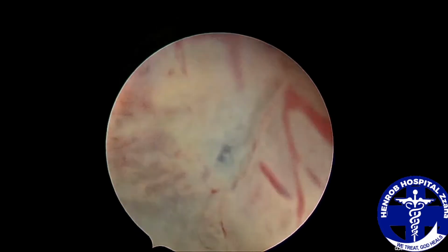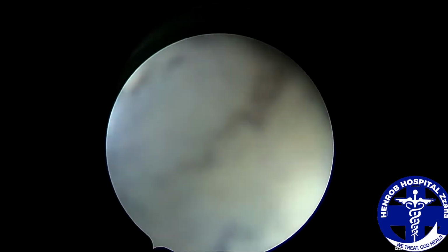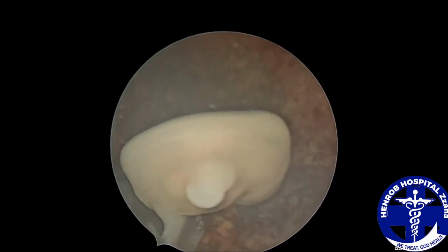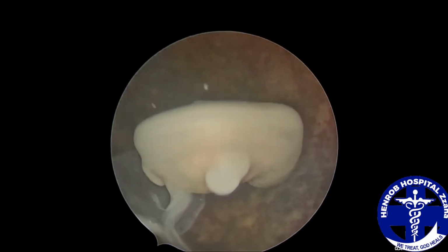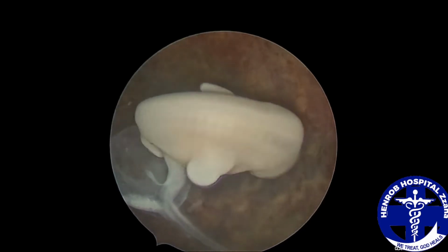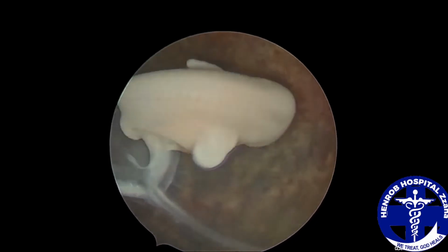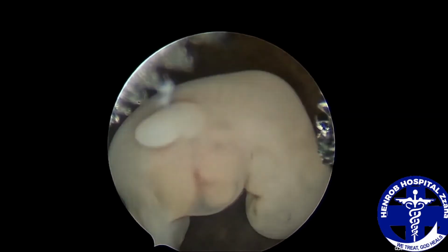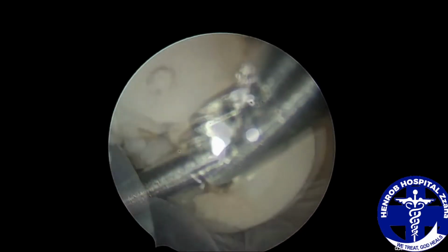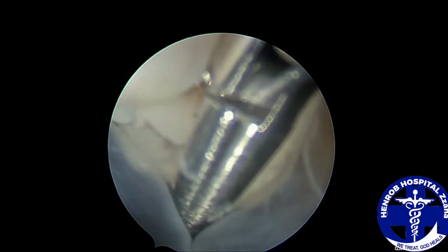Then you get your scope in, a 4 millimeter scope or less in diameter, and this will help you to visualize the embryo. You'll notice that you can have the complete morphological evaluation of the embryo with this good magnification, and if you have any abnormalities, they can clearly be seen. Then with a clean grasper, you can easily pick the embryo out of the sac.